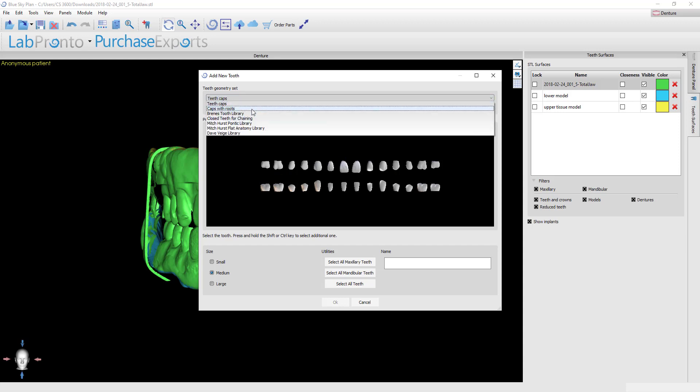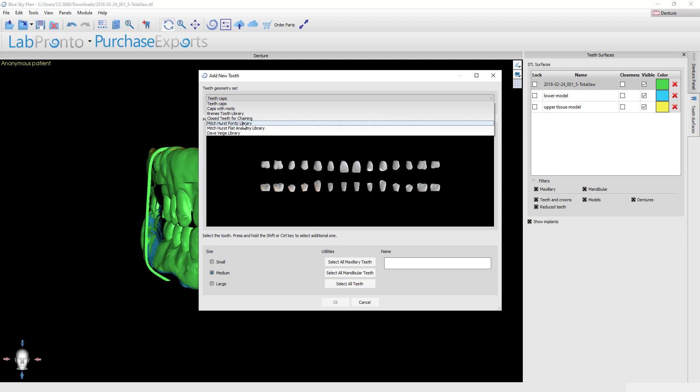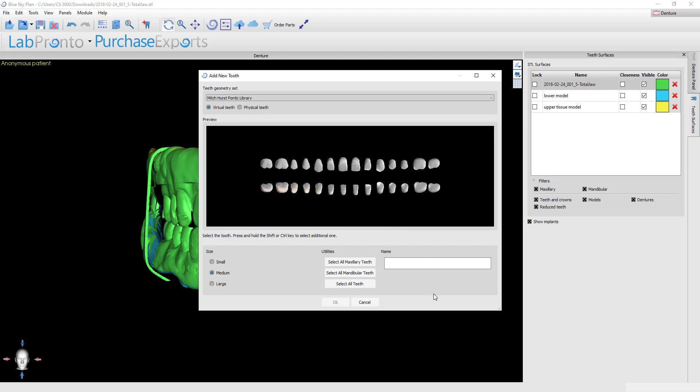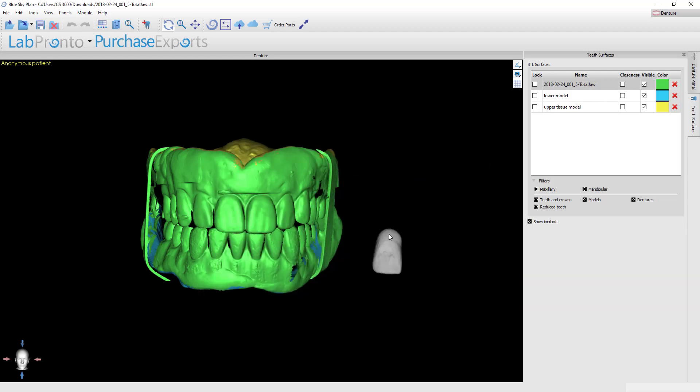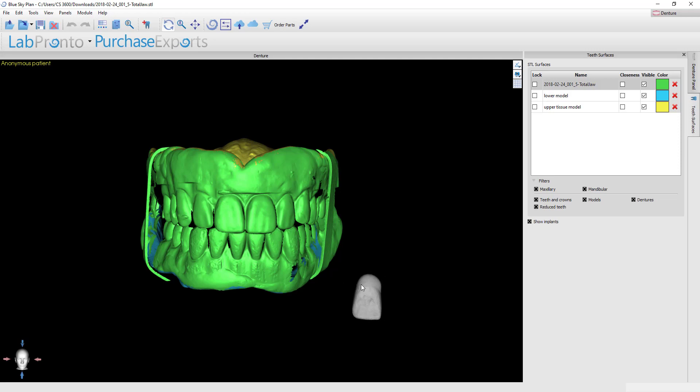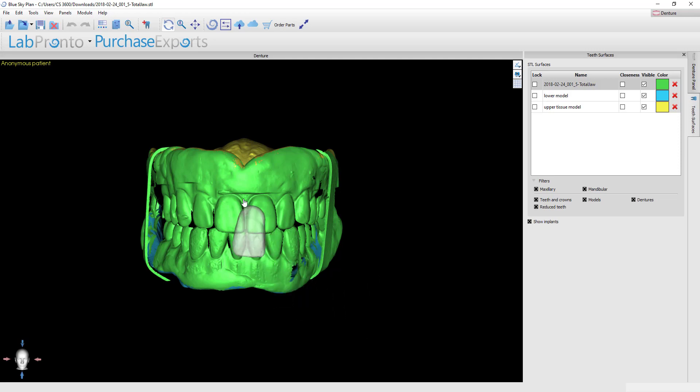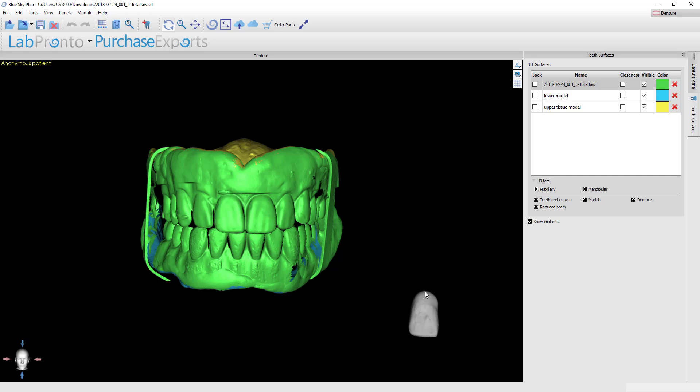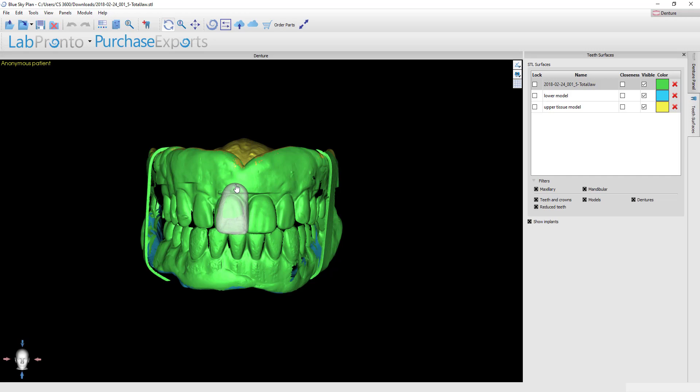You've got several libraries available. I'm going to use the Mitch Hurst Pontic library and I want to select all of the teeth since this is upper and lower dentures and then click OK. You'll notice that there's a tooth hovering underneath your mouse arrow. Come over to the models and you can see this is a right central incisor, so I'm going to come over to the area of the right central incisor on my models, hold down the shift key on your keyboard and then left click and that will drop the entire dentition into the case.